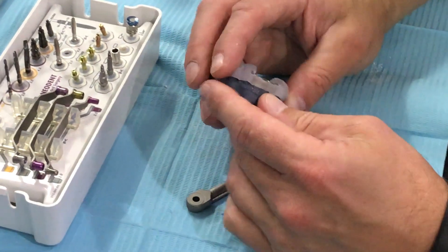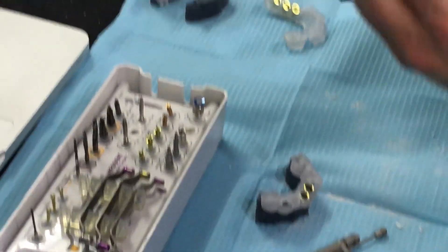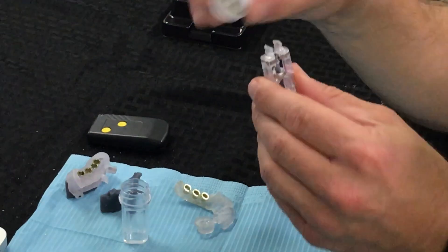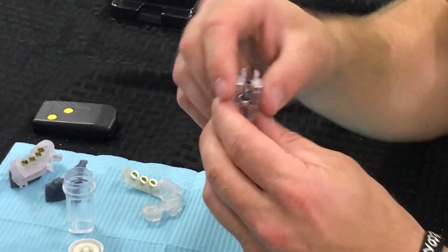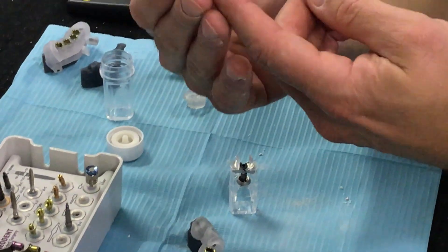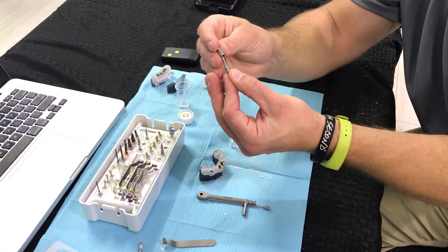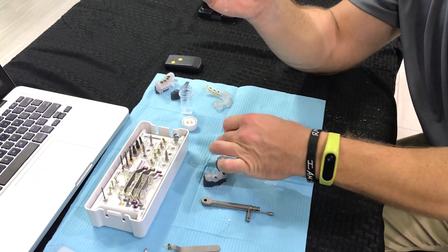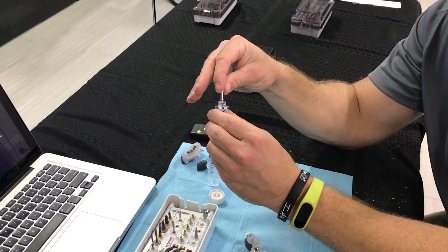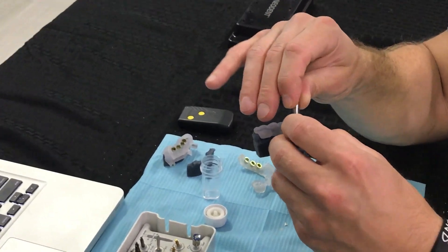I'm ready for my osteotomy to accept my implant and I want to do this fully guided. I'm going into my implant packaging, give it a turn so I can pull this up and out of the sleeve — I have my implant. Very important: I want to take my implant driver and take the adapter with the square head that accepts a torque wrench and attach the two. I slide this down the back of our implant driver and manually make sure that I seat this driver fully down into the implant. I want to start it by hand and keep the driver connected to this implant the entire way down.